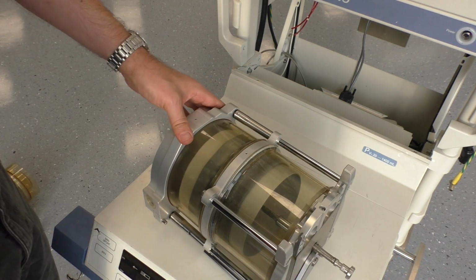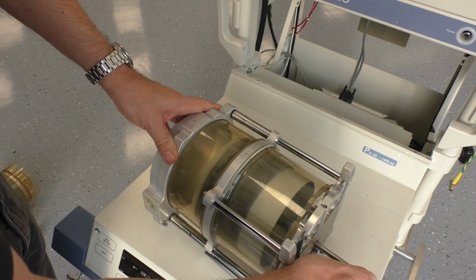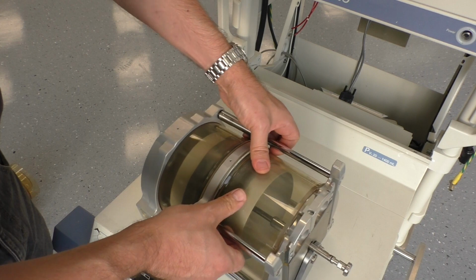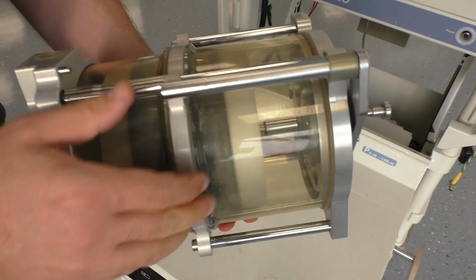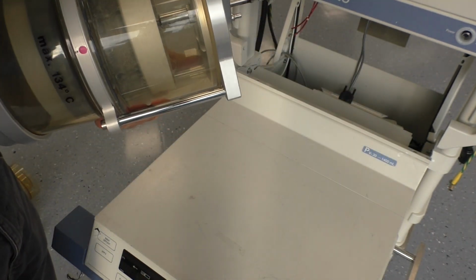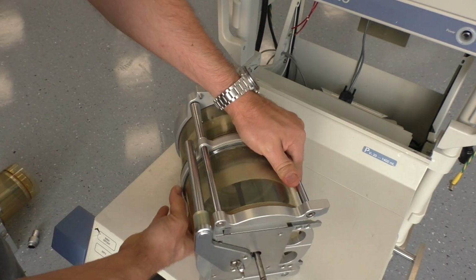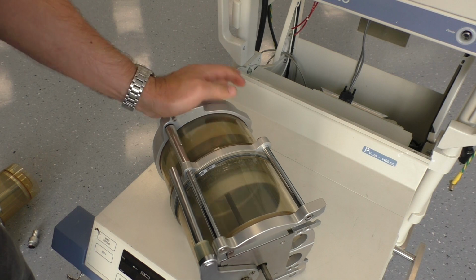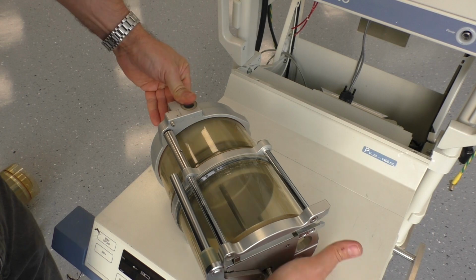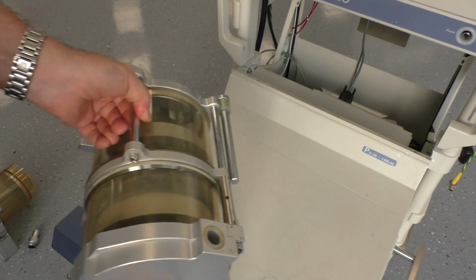So what you adjust is how much it pumps, only a short way or the full way, depending on the size of the patient or of the patient's lung, or whatever you need. That's what you adjust with the control box here. Okay. Yes, it's very tight. Would be a good air pump anyway.